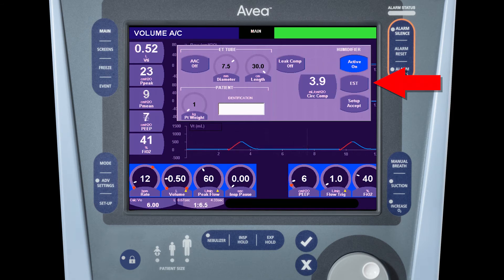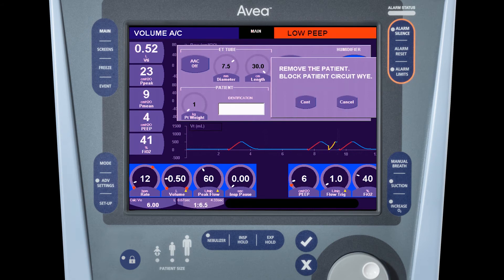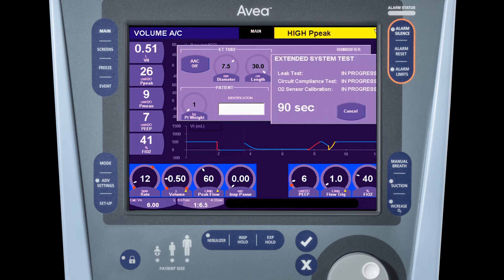To initiate the test, press the EST button. You'll be prompted to remove the patient and block the patient circuit. Pressing the continue button begins the test. The initial phase of the test is the leak test and circuit compliance test. These typically complete at approximately 15 to 20 seconds.